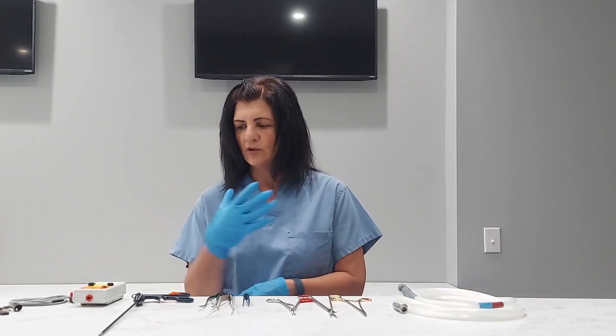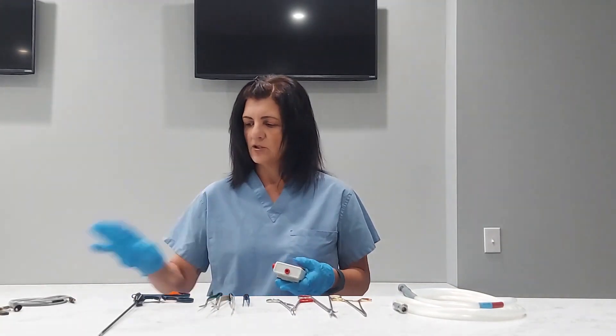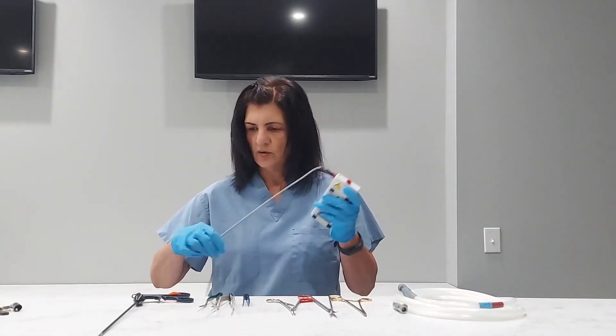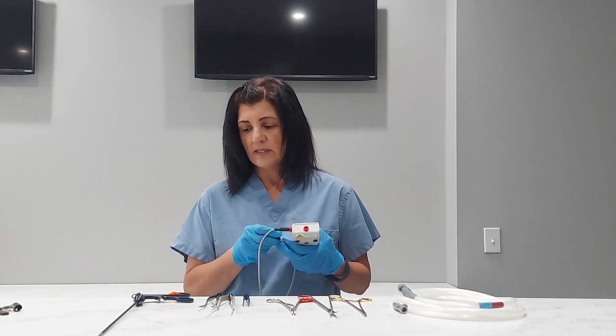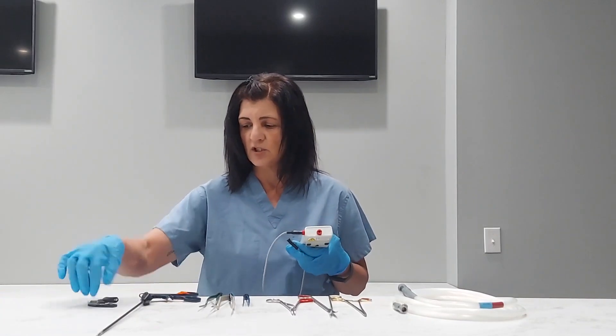The next thing you want to do is check your tester and make sure you have battery power. Get yourself set up and get ready to go. So I'm going to hook my cord up. The first item that we want to test is our laparoscopic instruments and we're going to set up our machine to do that.